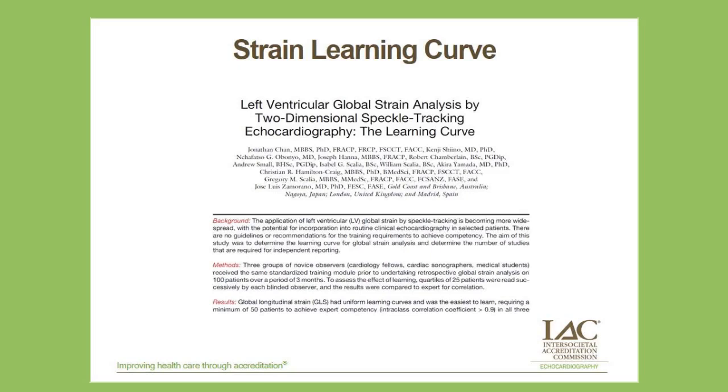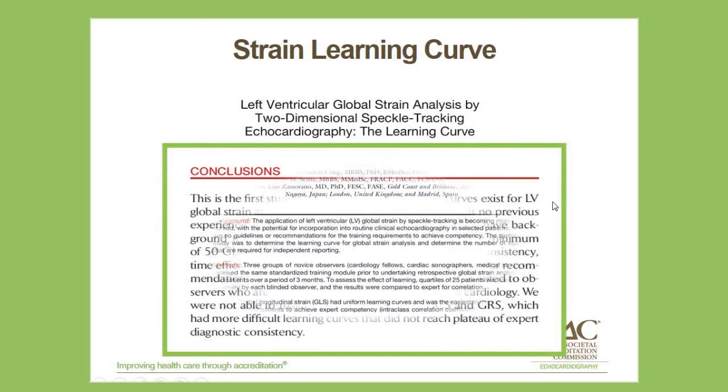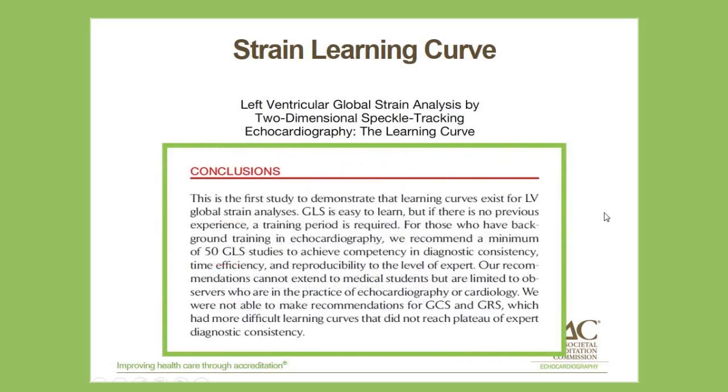Okay, first of all, I wanted to talk a little bit about the learning curve with strain. We as sonographers know that most anything we do, there's a learning curve with ultrasound. So this article very nicely compared sonographers to medical students and everyone else that didn't have echo experience. And what they found was that a sonographer needs about 50 studies in global longitudinal strain to provide consistency and reproducibility with their strain.